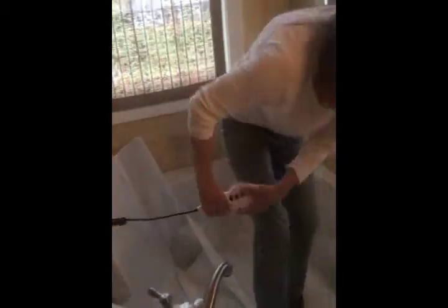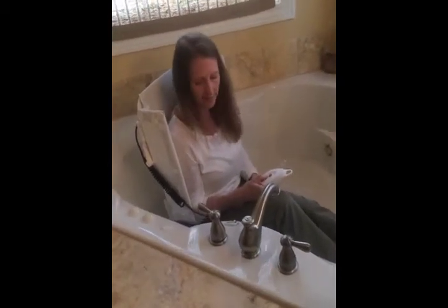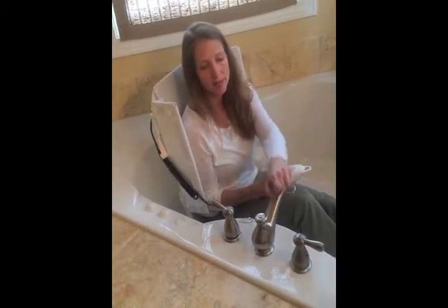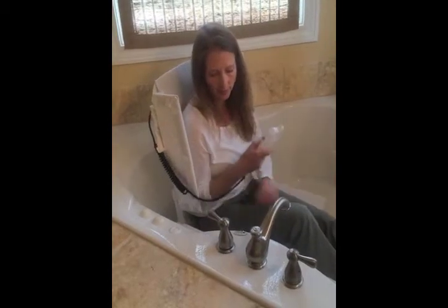These bath lifts were designed for a standard size tub. They do have suction cups on the bottom so that they don't move, but they still do move sometimes to some degree. This is a circular tub — a non-standard tub — and I don't always recommend these lifts for these sorts of tubs. It can be in the way if you're trying to transfer and don't have very good balance, and it can be a little tilty. It does maintain its balance quite well, but not as well as in a standard tub.